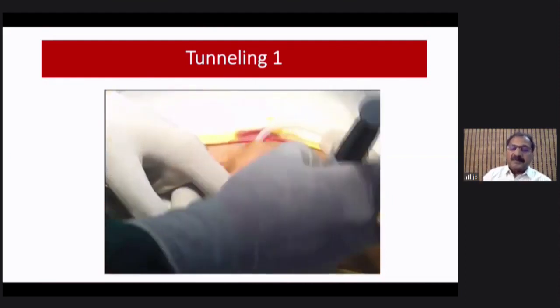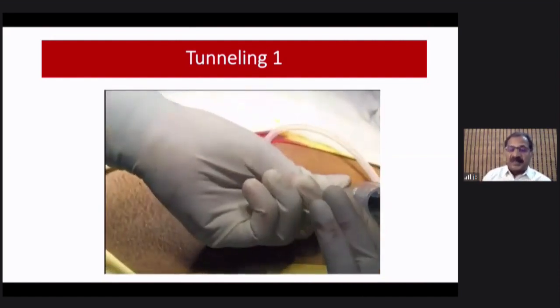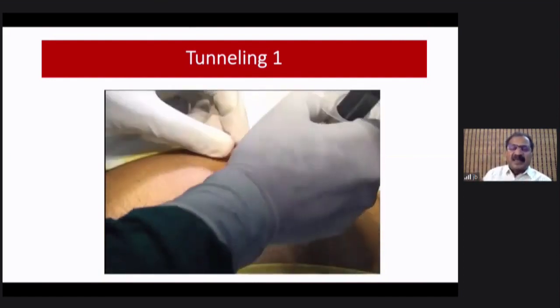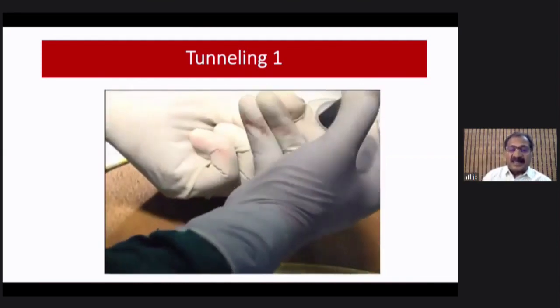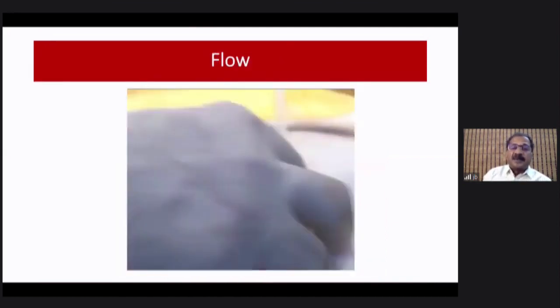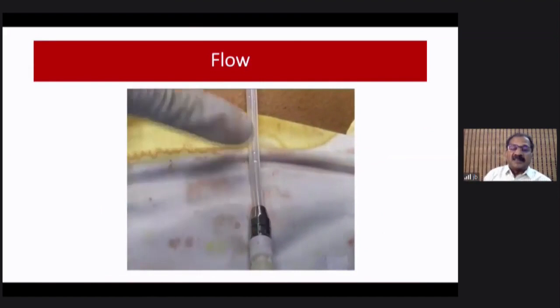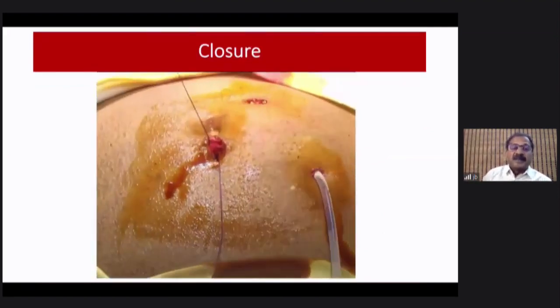And this step, I hope this video is able to show you, but it is not difficult. That way, both the cuffs get buried very nicely, and the chances of the cuff curve getting straightened up is very minimal. So you have 3 points: the inside entry point, and for the tunneling sake, another incision upwards, and again the exit point, and over.